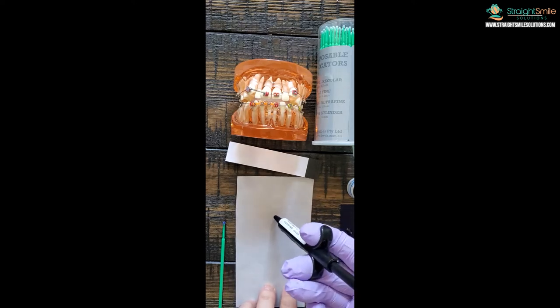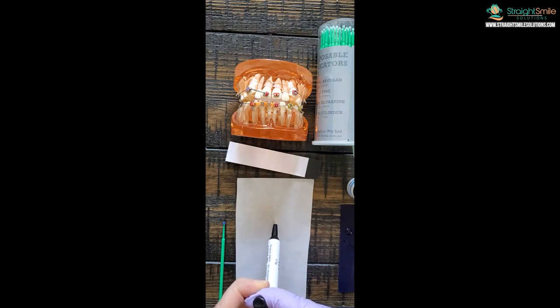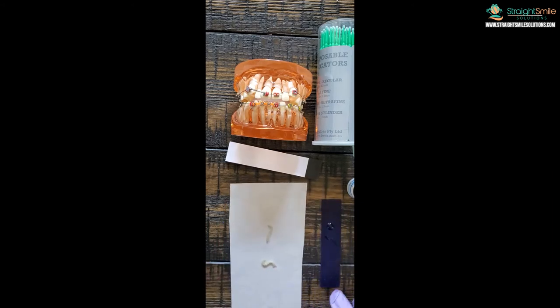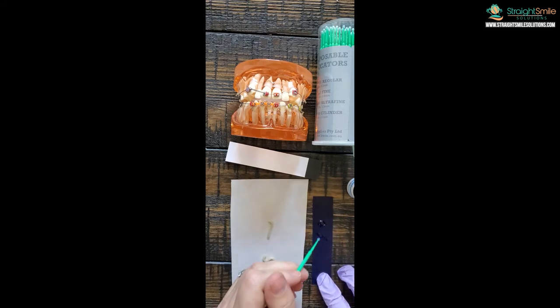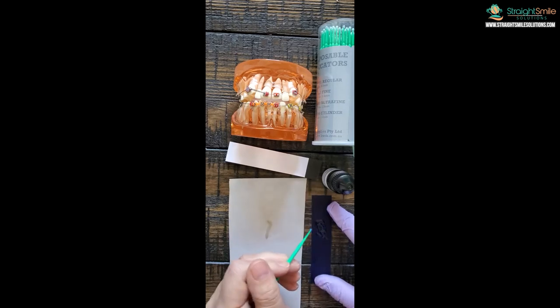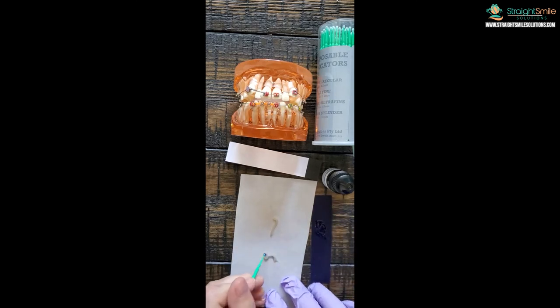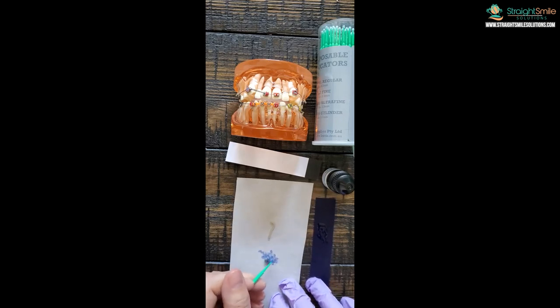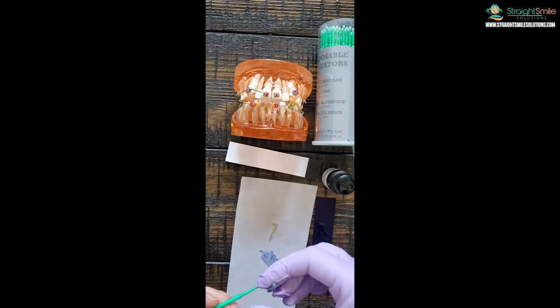I make two little blobs of composite — express one out, or do one big one and split it in half. My trick: I take a piece of articulating paper, use the blue side (not red, because red looks like blood), and put a drop of primer on it with a micro brush, mix it around so the brush turns blue. Then I use that to mix and tint the composite a subtle blue. I don't etch and prime the molar because I don't really care if it falls off — in fact, I want it to fall off because it makes my life easier.